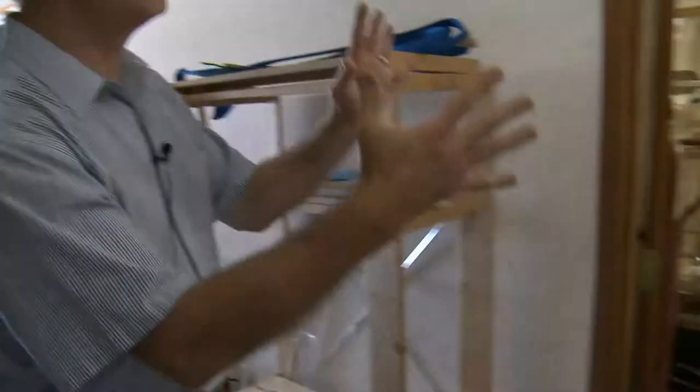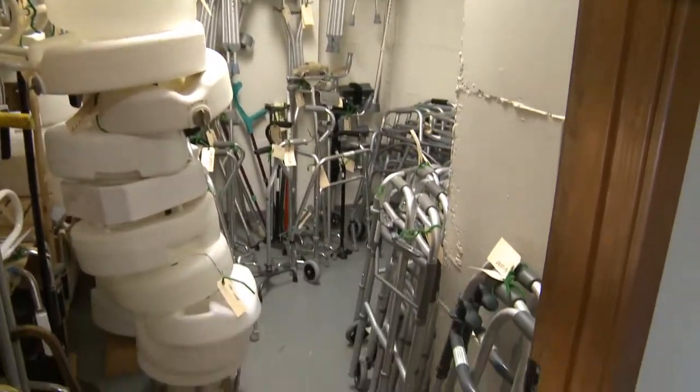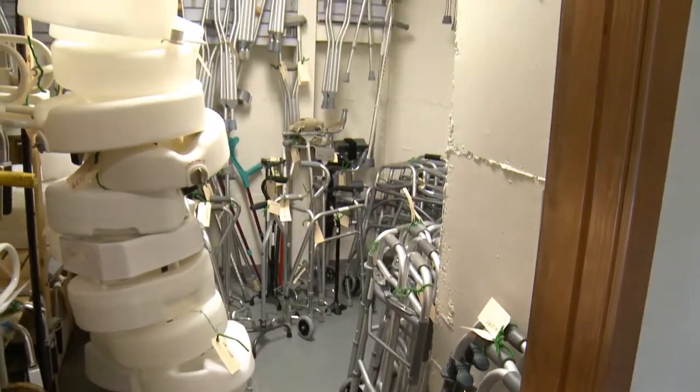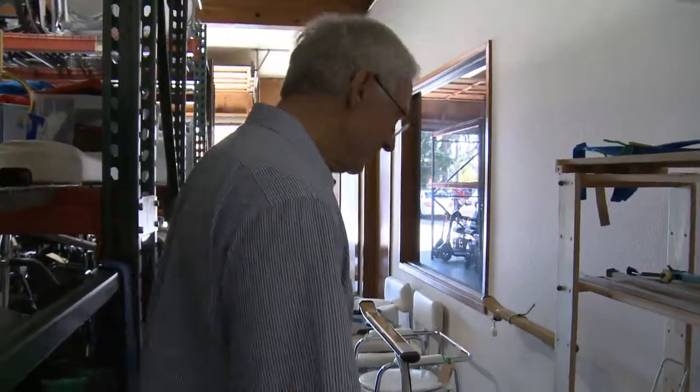And here we have our little area for canes, crutches, walkers, raised toilet seats, and grab bars — there we have it.